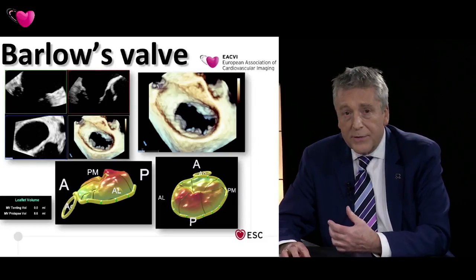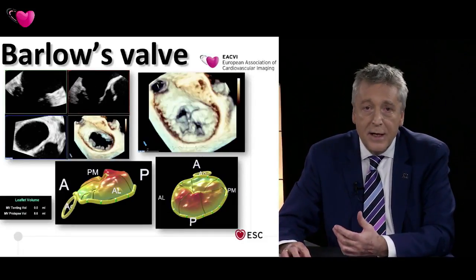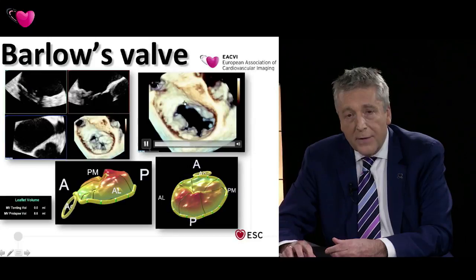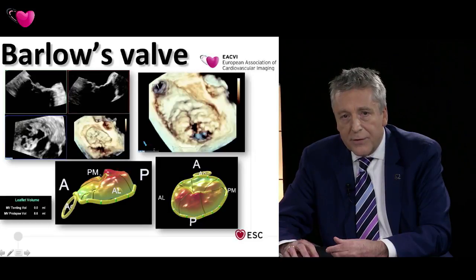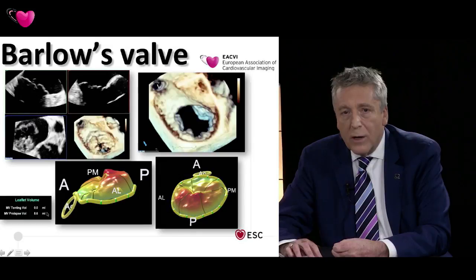But of course, sometimes just a visual appreciation is not good enough, and we want to quantify. And there are tools available from a number of vendors now which allow us to do this in a semi-automated way. And this is one such tool which creates a geometric model of the mitral valve, in this case a Barlow's mitral valve, as you can see. And this generates a number of measurements in a semi-automatic way as well.